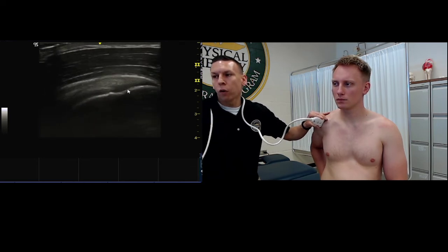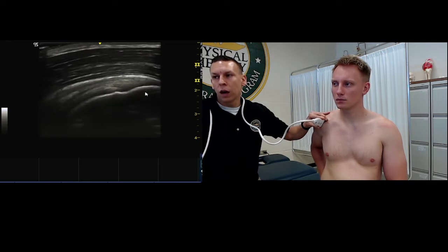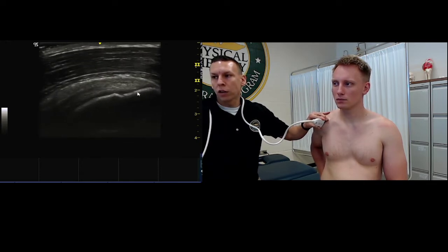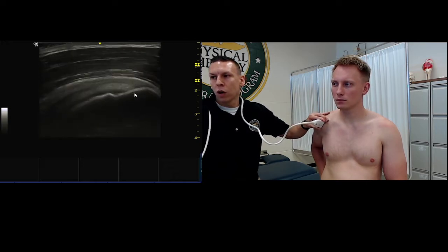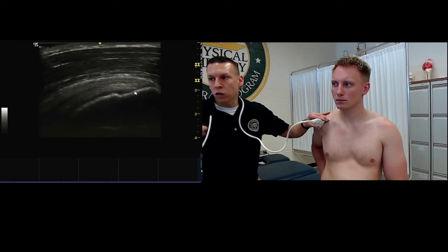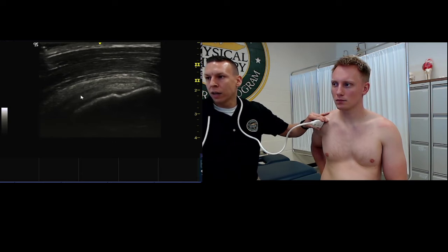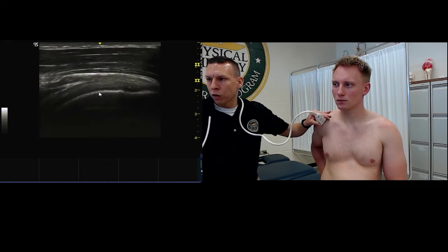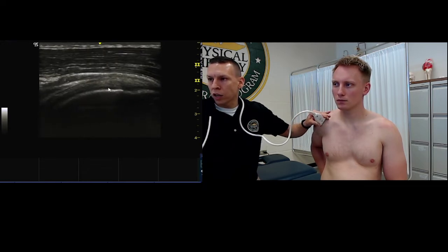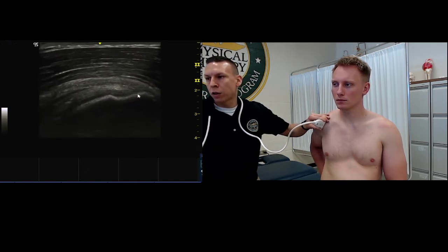From here, we're looking for what we call the S-shaped curve of the greater tuberosity. Now, this is the start of the S-shaped curve we're looking for, and when you start to identify it, we're trying to find fibers coming in and coming down and attaching to the bone here. You can see parts of the tendon come here. If you look a little further up the shoulder, we're going to see this is all articular cartilage underneath. And we want to find this S-shaped curve here.